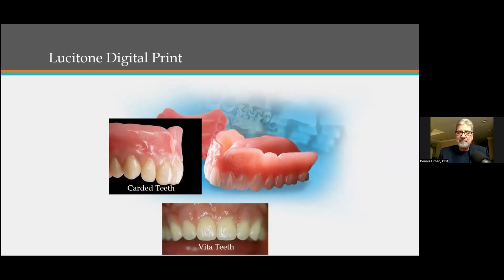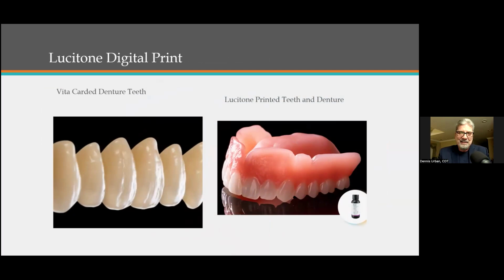So just as a little comparison, you see on the left-hand side, we have the carded teeth, the traditional teeth, and the printed teeth on the right-hand side. We're still not up to par with what we had with the carded teeth. Let's put it that way. So we're getting there, though. Okay. Again, on the left-hand side, carded teeth, and you see on the printed teeth, a little more anatomy and a little more aesthetics with the carded denture teeth.